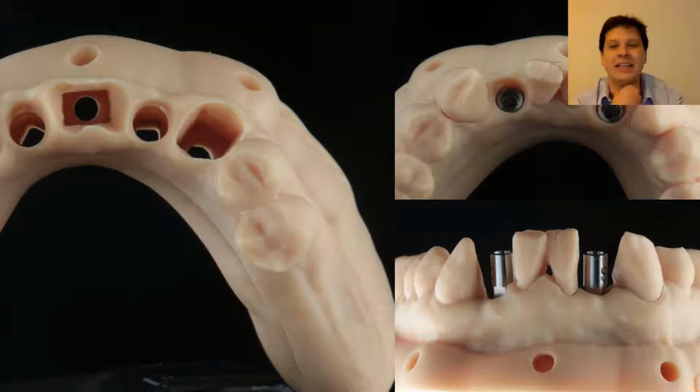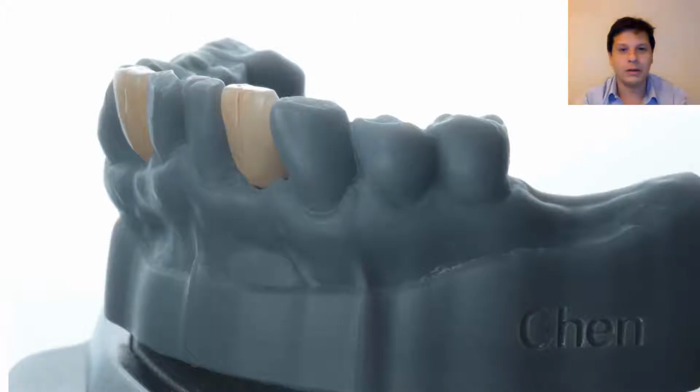Now, the big advantage is the accuracy and the detail that these models have. They have nothing to do with cast. I mean, I loved cast for years, but now we don't use cast anymore, especially in some situations, because look at the detail in these models. Now you can take out the teeth like a Geller-type cast model, and you can check the contact points, and the lab technician says thank you for that, because now you can do a very nice job on these models.